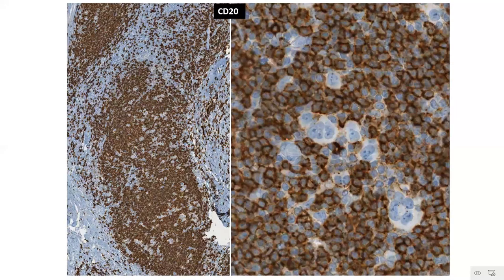What about the immunophenotype? Immunophenotype will be more or less fitting along with the description of the immunophenotype that we had priorly covered when we talked about the normal IHC profile of the classical Hodgkin-Reed-Sternberg cells. These cells are negative for CD20. As you see, there's no surface expression of CD20 while the background lymphoid cells are showing positivity. Observe this cell. The membrane is devoid of expression of CD20. So these are CD20 negative cells in a background which is rich in small CD20 positive B cells.